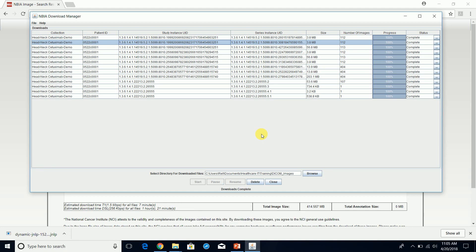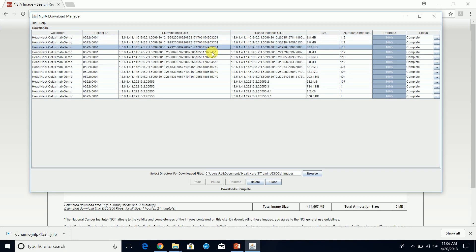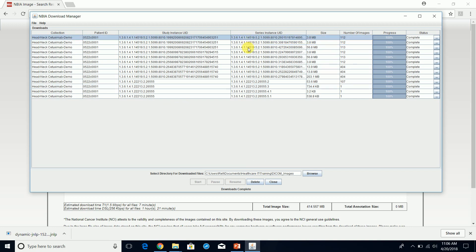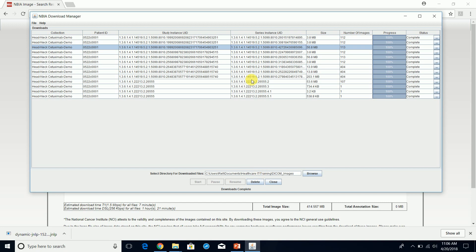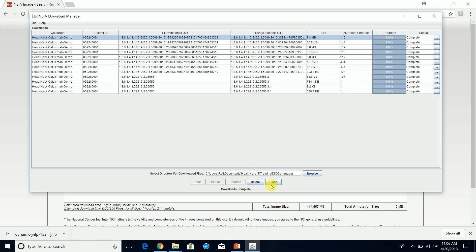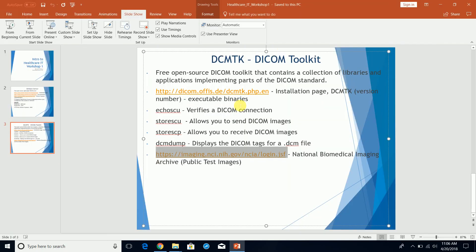All of the downloads have completed. We have more than one study because we have multiple study instance UIDs — four studies in total. This is completed. We'll just close this for now. Now if we go to our folder, we can see the downloaded data.